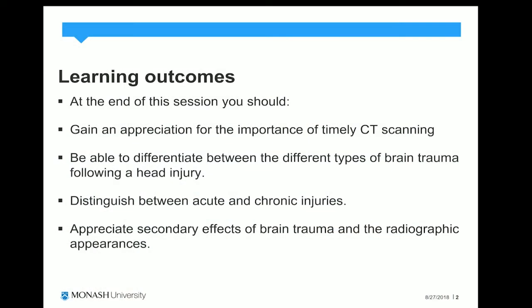So at the end of the session, I hope you would be able to gain an appreciation for the importance of timely CT scanning, but also to be able to differentiate between different types of brain trauma following head injury. It's really important that you are able to distinguish between acute and chronic brain injuries, and then also to appreciate secondary effects of brain trauma as well as its radiographic appearances.